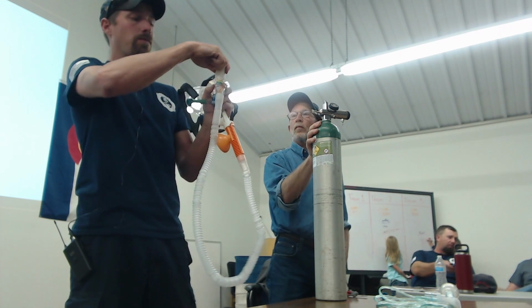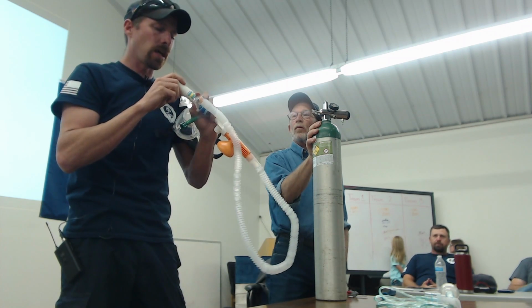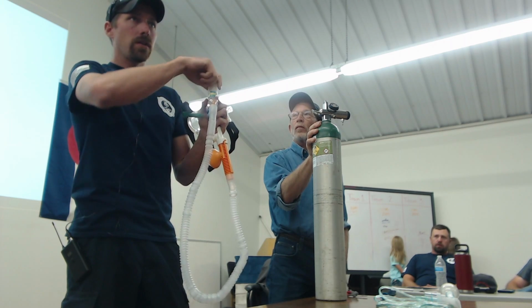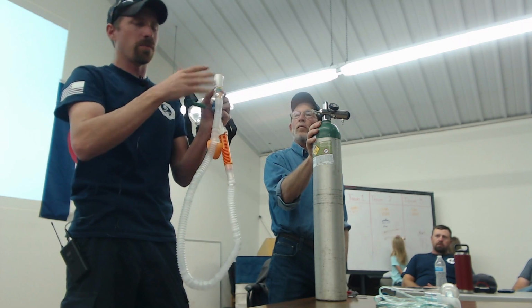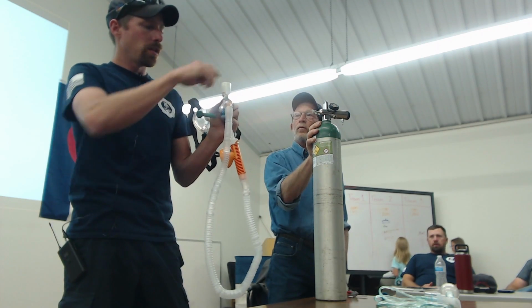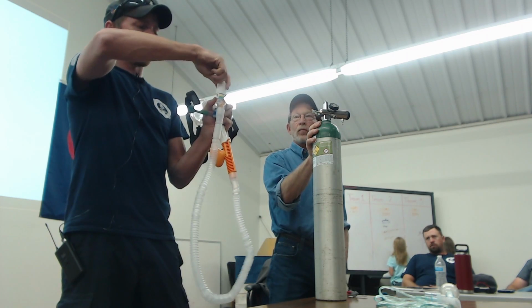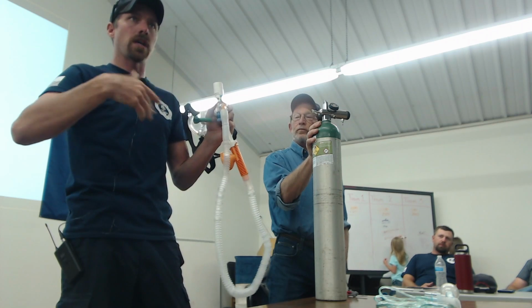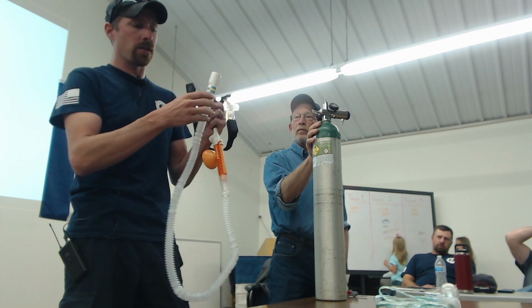If for some reason maybe you did make a mistake and you didn't get quite to the click, it's not too big a deal. The manufacturer says that if you are at least within a little bit of that rotation, and if you didn't make it all the way to click, you're still going to be plus or minus about 0.5, so you're still within therapeutic range. So it's going to start at the 5. You can go all the way up to 10. Of course, we start at the lowest setting and see how the patient tolerates it and see how their condition improves or doesn't improve, and then modify those settings accordingly.